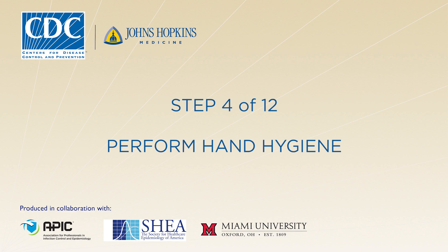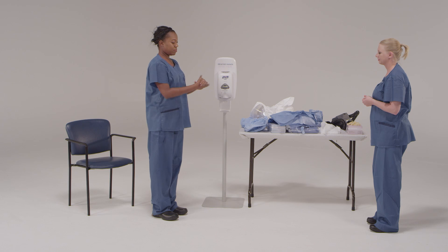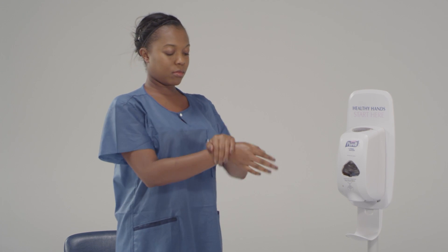Do you see any problems with your equipment? No? Great. Go ahead and use the alcohol-based hand rub. Make sure that you get in between your fingers, the backs of your hands, and your wrist. Great. Now make sure that your hands are completely dry before we move to the next step.